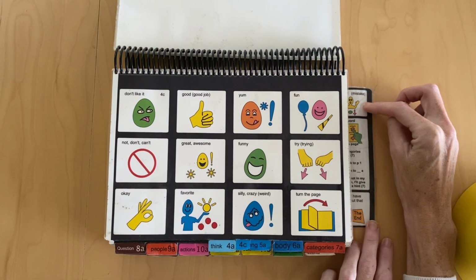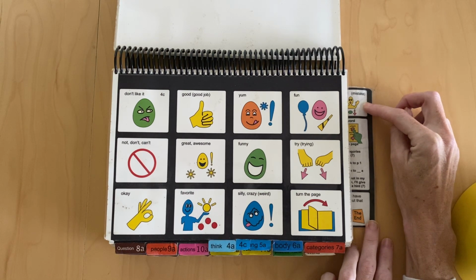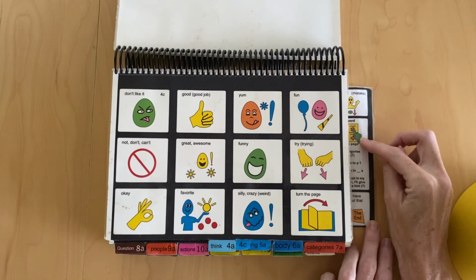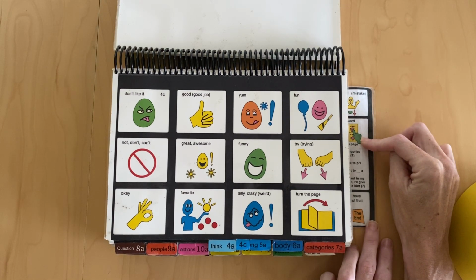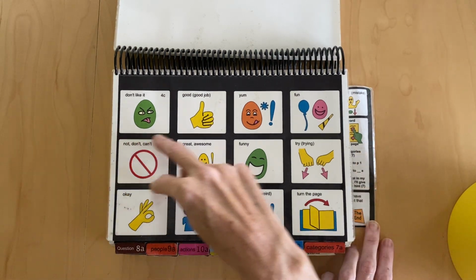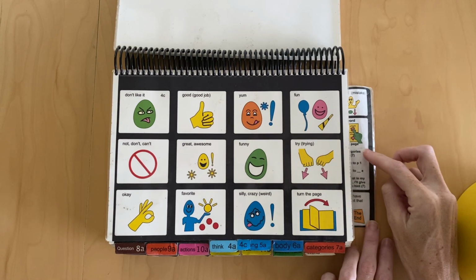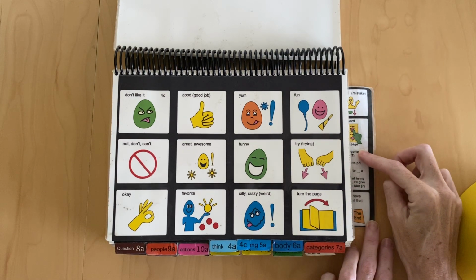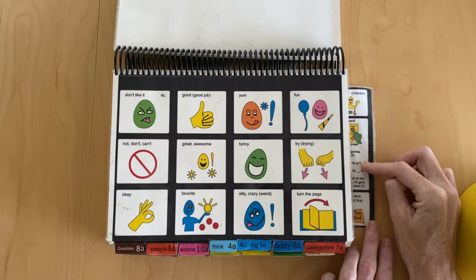First, I'll ask her, oops, made a mistake. She says no or gives no response. I say, do you have another word? If she says yes, then I continue asking these questions. Is it on this page? If she says no, then I say in categories. No. Back to page 1.